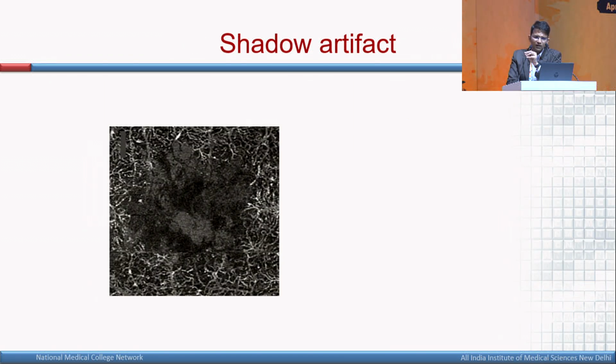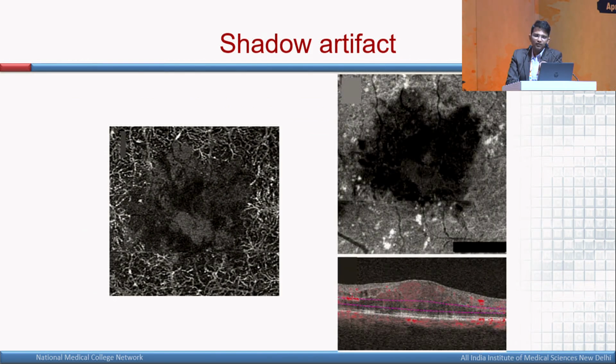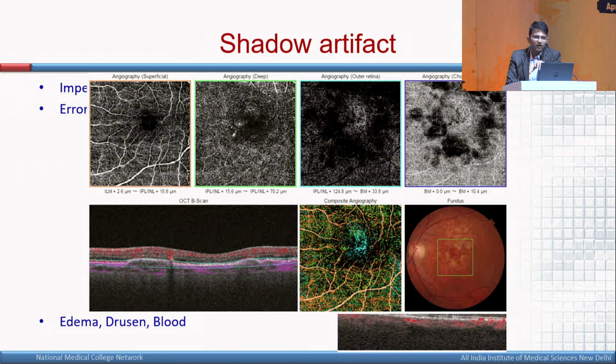and then look for the abnormality appropriately. Now shadow artifacts, as I told, is the last artifact, that in this image you can misinterpret as a flow void, but when you see the signal intensity, you know that the signal is already lost. So in the B scan image, you see there is a lot of edema. That's why the signals are lost, and it's not a flow void. And another example in which you see that there are different flow voids in the choriocapillary slab, but when you see the fundus image and the OCT image, you know that there are a lot of drusen, and therefore it's a shadow artifact which is occurring.